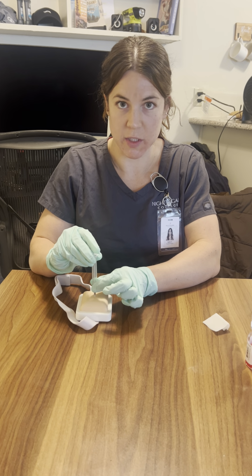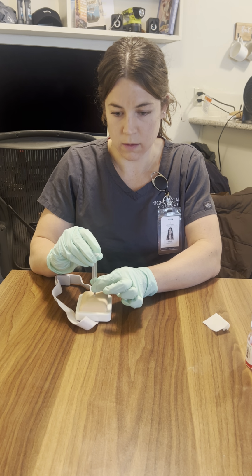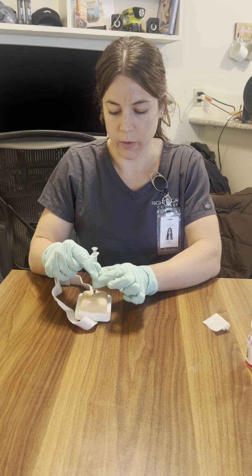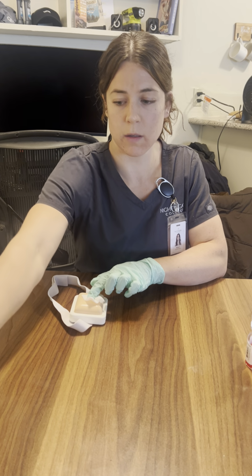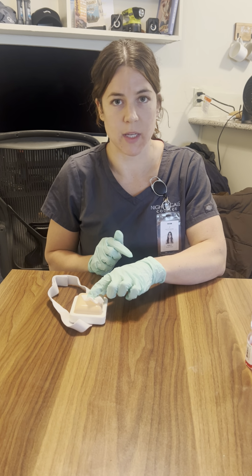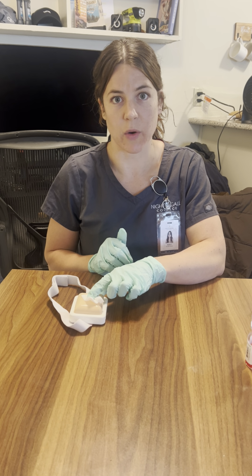After we finish the injection, we want to leave it here for about 10 seconds. We are going to remove the needle, apply gauze, dispose of this in the sharps container. If the patient requests it, we can bandage it. If they don't need it, then we're just going to go ahead and leave it there.